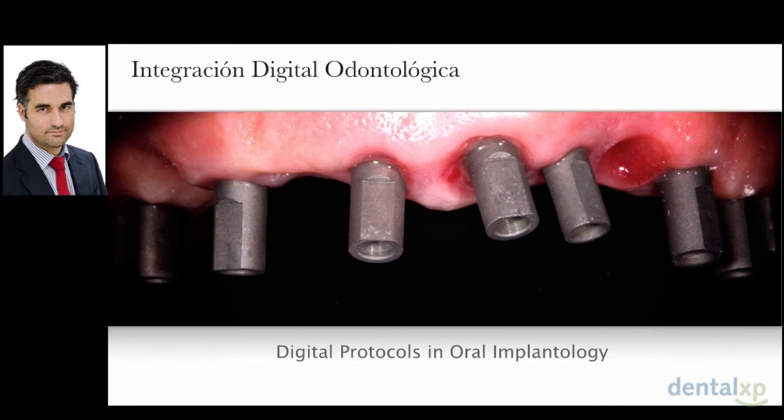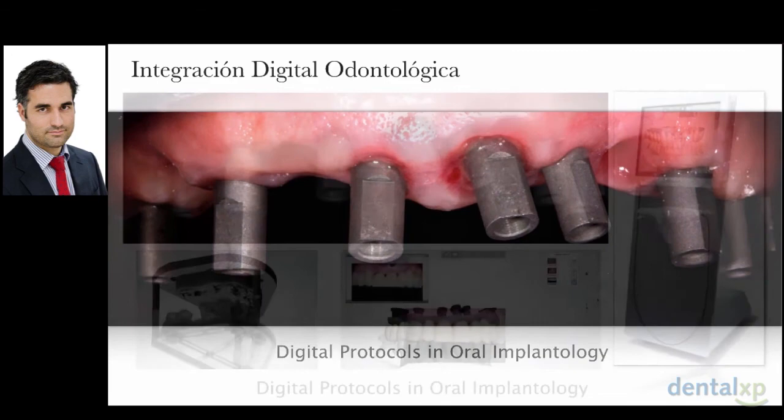This was the first digital impression with 9 implants. This was some kind of test, and I did it with the engineers from FIBO. Of course, this was great help from them to do this case, because it is a very difficult case to do with a digital impression, but we did a test.